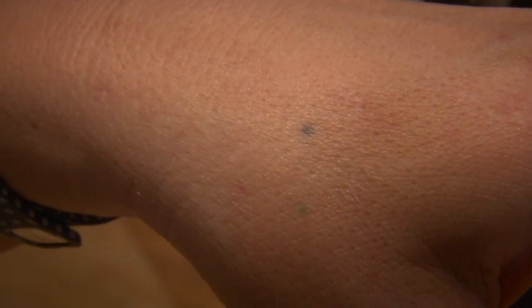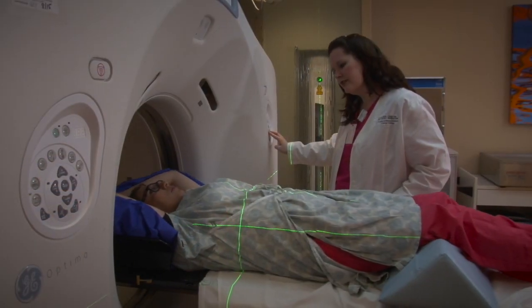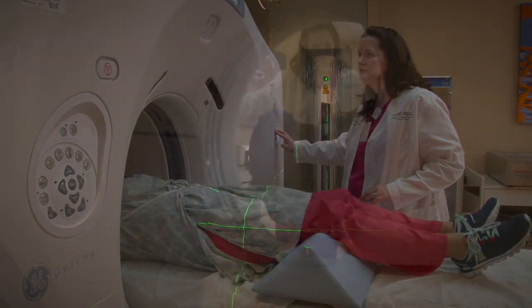After your radiation oncologist locates the exact area to be treated, we will mark your skin with several small, freckle-sized tattoos. We use these tiny permanent dots to make sure we accurately position you at each treatment session. The radiation therapists use the tattoos to set you up in the exact same position you are in today. We create the tattoos with a little dot of ink and a needle stick. You will be able to bathe without worrying about washing off the tattoo marks.